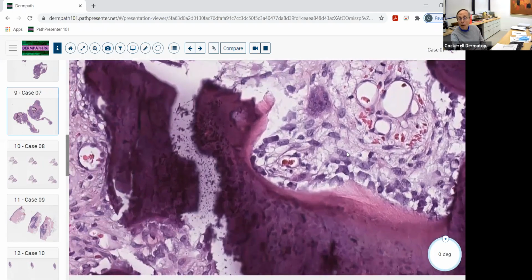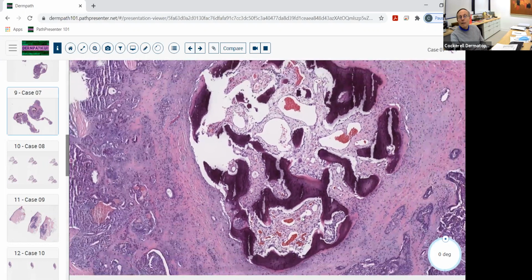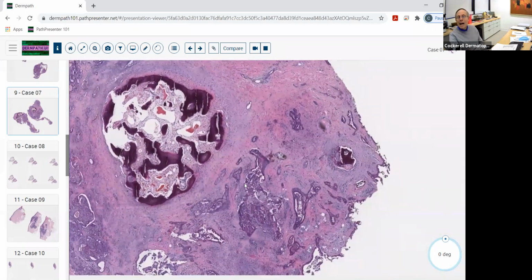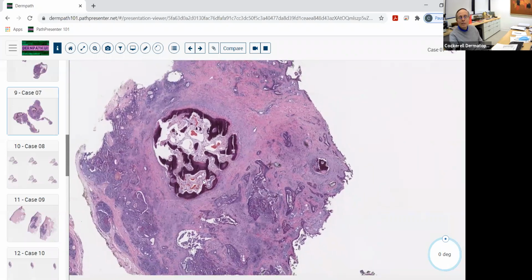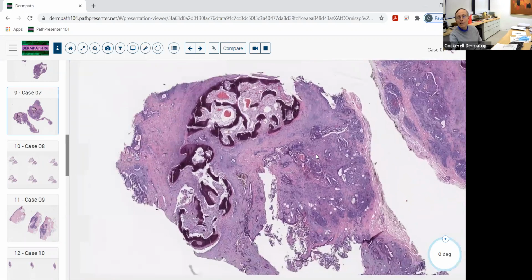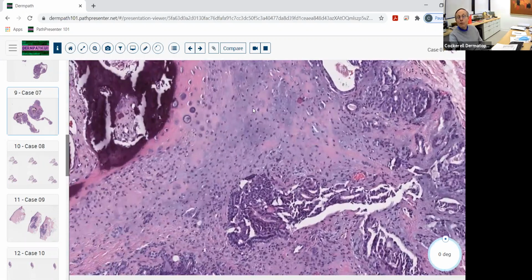And you actually have a little bone marrow in here, and I think I may have mentioned this before, but there have actually been a few case reports of benign ossification in skin lesions, and then people look at the bone marrow that's in there and they find leukemia or something like that in the bone marrow. So that can happen also. It's pretty rare, but here you see the nice mucin that's become cartilaginous.